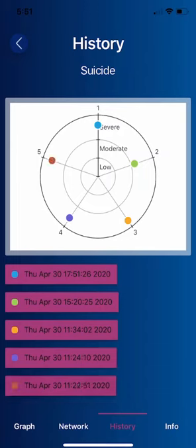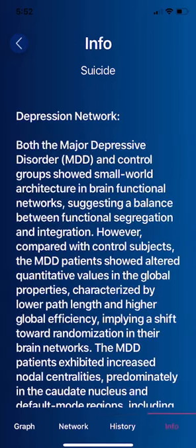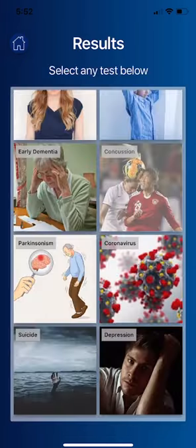We can then evaluate the history on this radar map. Maybe it's severe initially, and now it's going down to moderate. As you repeat this self-assessment questionnaire over time — one, two, three, four, five tests — you can track the severity of your symptoms and evaluate what this means.